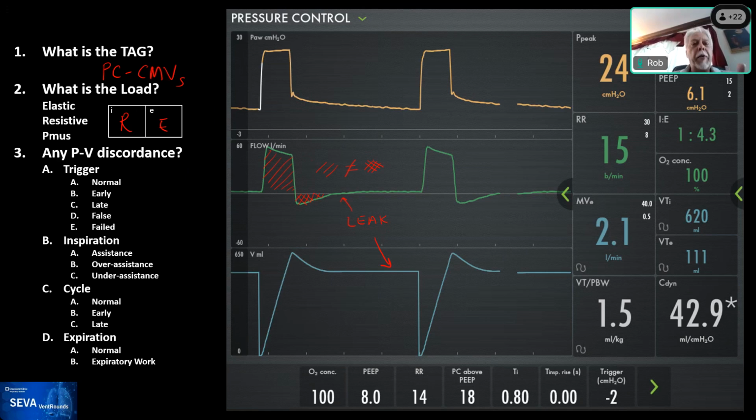So if you were to model this with an electrical analog, what you would see is a resistor and a capacitor in series or in parallel with a big resistor, right? So the resistor and the capacitor, or the compliance, represents the airways resistance and the compliance of the lungs. And the big resistor that's in parallel with that is the leak out to atmosphere.